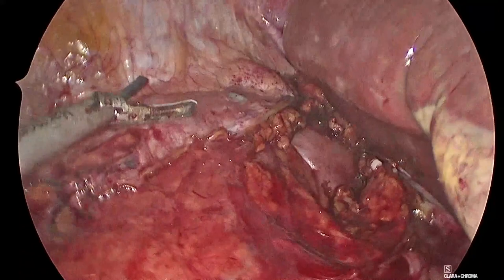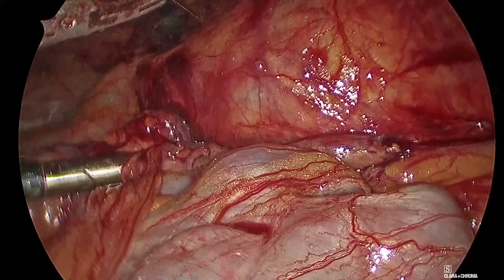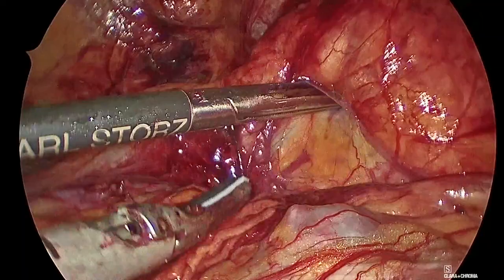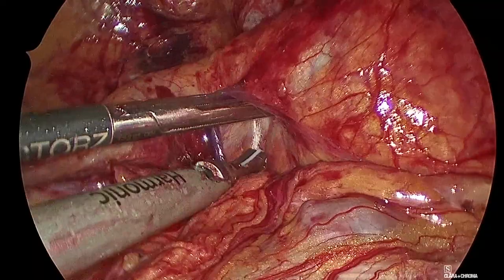So I'm expecting to see my renal vein somewhere in there. So let's go down here and dissect a little bit more of this renal pelvis. We have to be careful of the gonadal vein. Where is it leaking? From here, probably. Okay. The gonadal vein will be somewhere down there. And this, I would say, is the only tricky part of the surgery here: to make sure that we don't injure the ureter or the collecting system. Because here is where we may have problems related to the sealing.